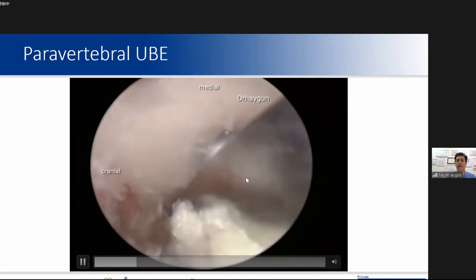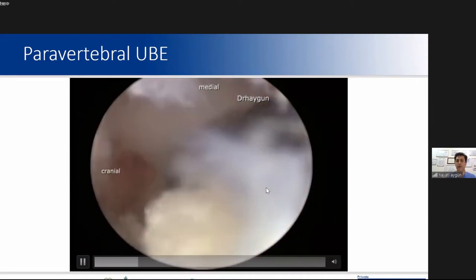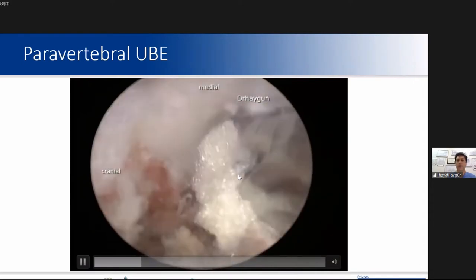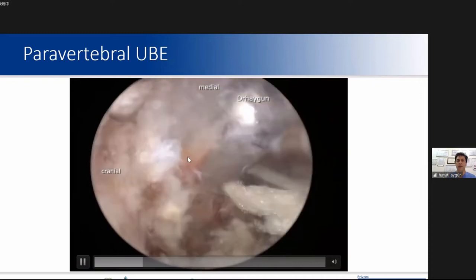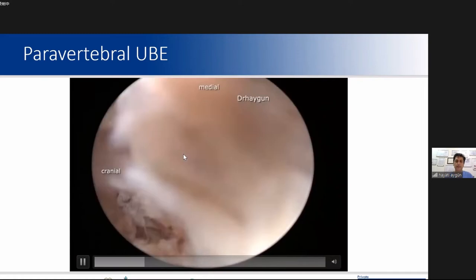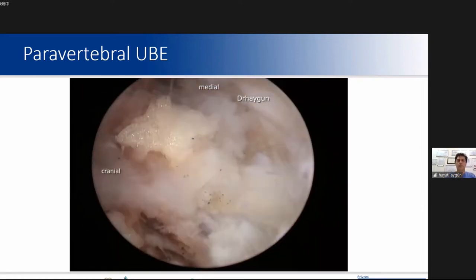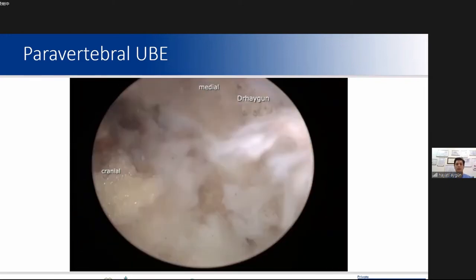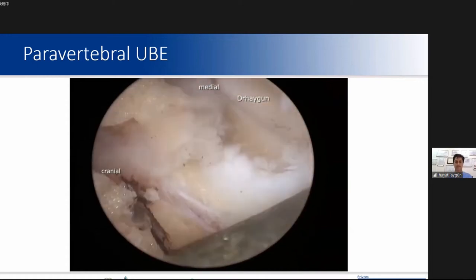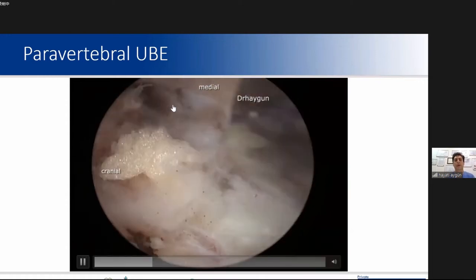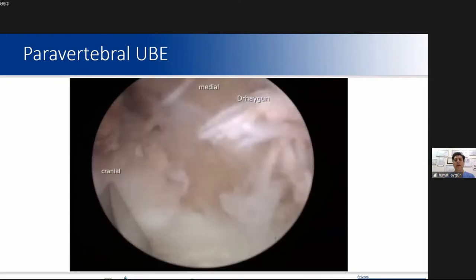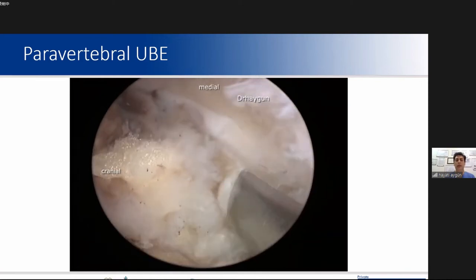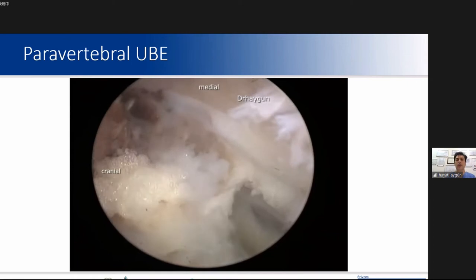We shave the superior articular process tip, then shave the laminar lateral edge. The isthmus is identified. At this step, you may see significant bleeding from the dorsal branch of the vertebral artery. Then I use osteotomes to make a deep osteotomy to the tip of the SAP.